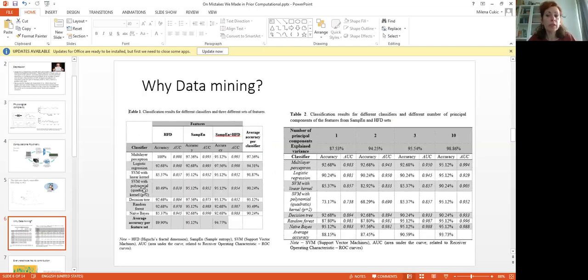So this is part of our results. On the left, you can see that we characterize the data, meaning EEG of depressed and healthy people, with two nonlinear measures, and then use 7 of the most popular machine learning models, and all of them ended up with very high accuracy. On the right side, you can see that if you use PCA for feature selection, even 1 PC or 2 or 3 can already solve the task in a very successful way, but you can also use more if you want.